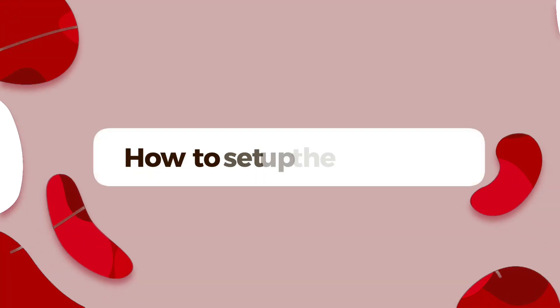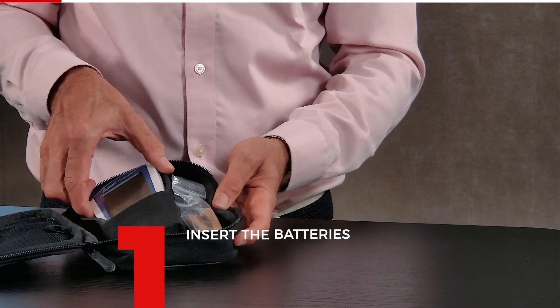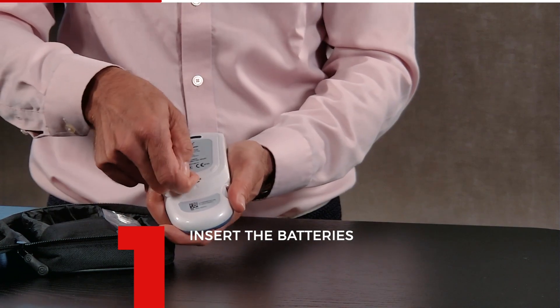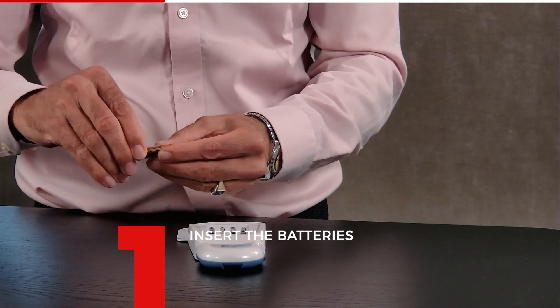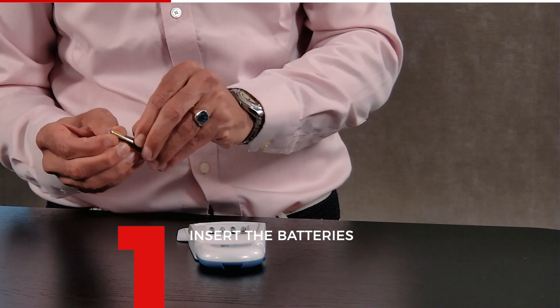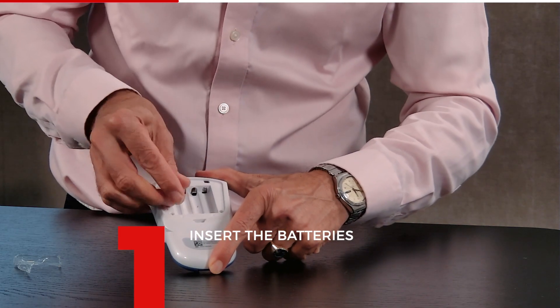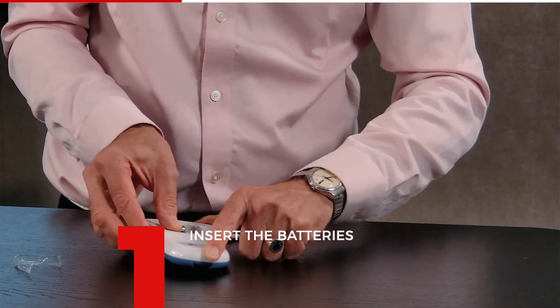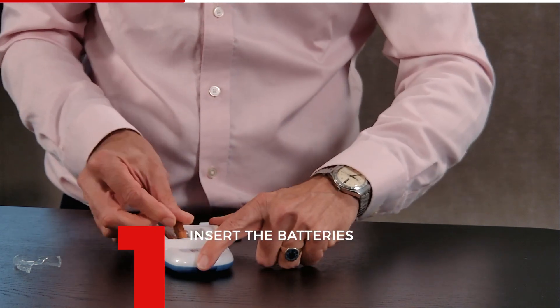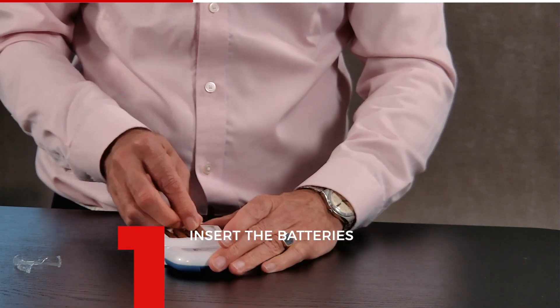Now I'm going to show you how to set up the meter. To turn on the meter, we need to insert the batteries. Open it here — it's a bit difficult to see, but you need to take the plastic off. It says plus and minus here. Insert all four batteries according to the markings.